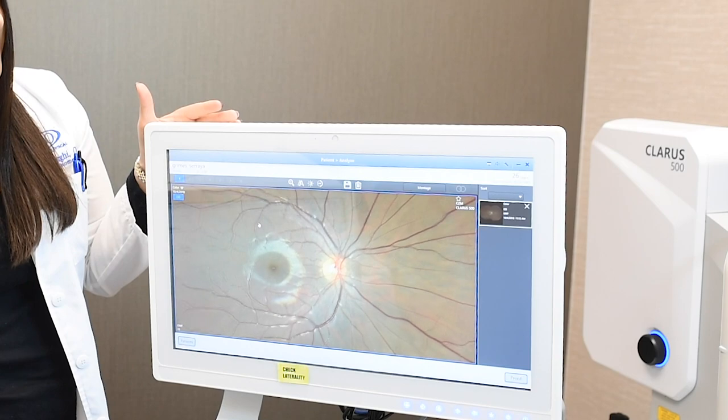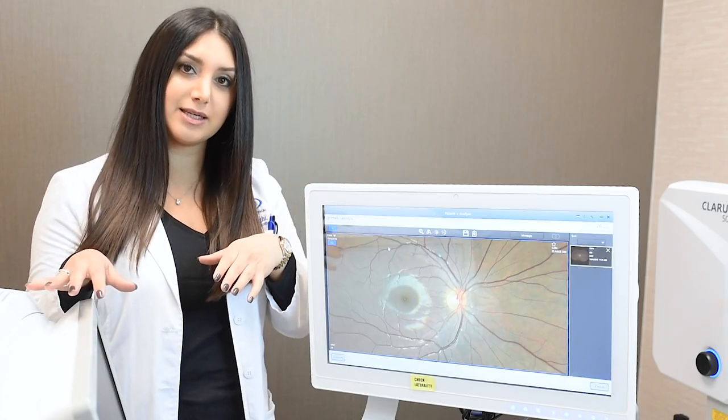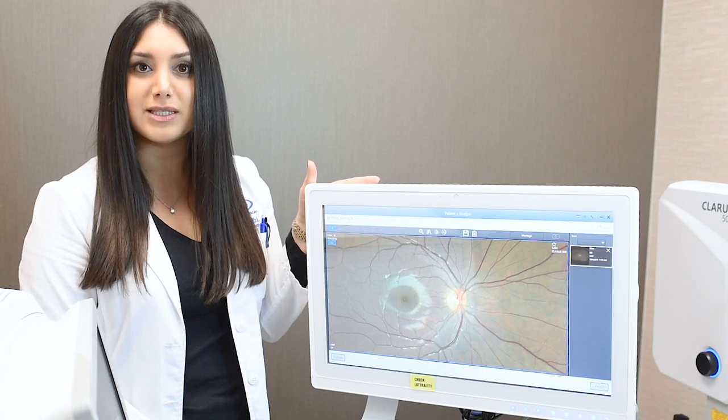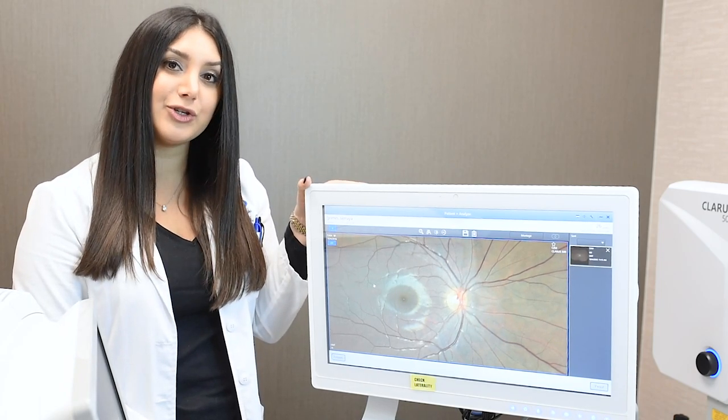If we see something and we want to look in the layers beneath the retina, we use the OCT to allow us to look underneath and make sure the pigment looks normal and there's no fluid or any complications from things like diabetes, high blood pressure, and just normal aging.